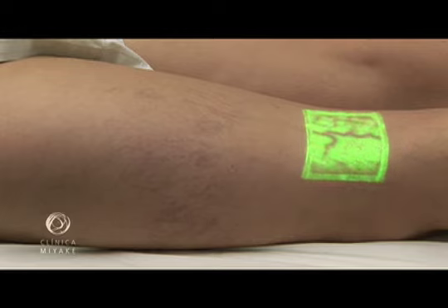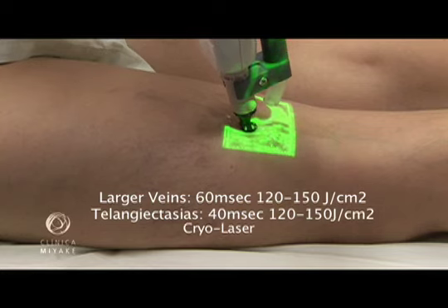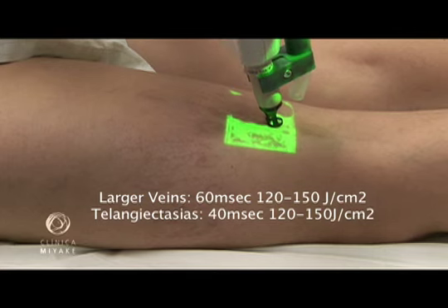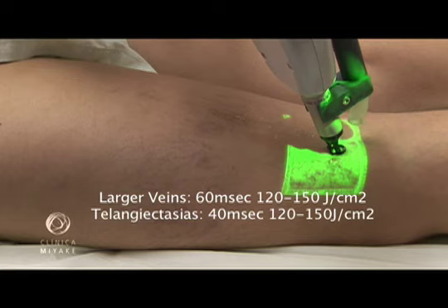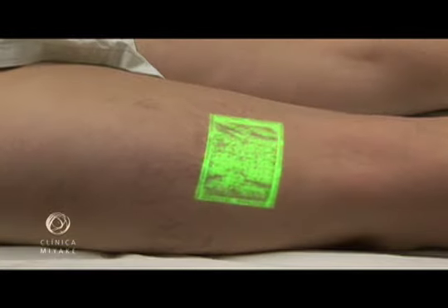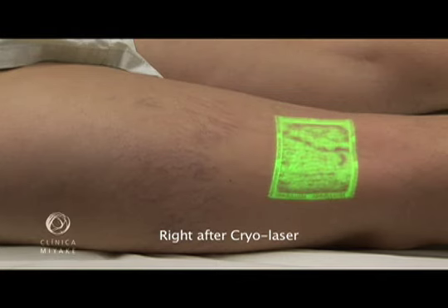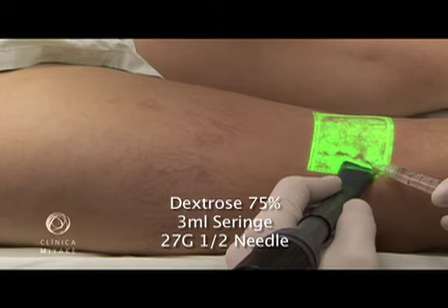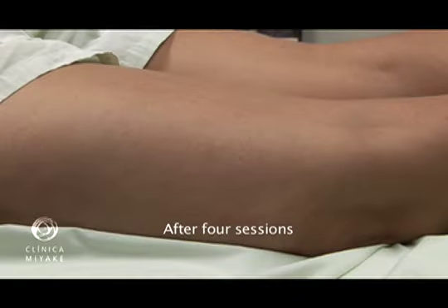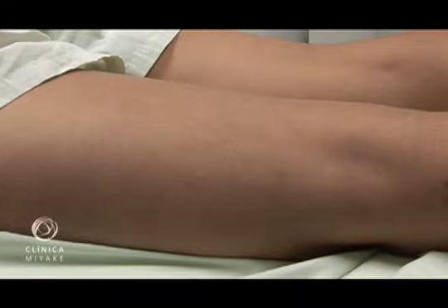The laser settings we use today are 60 milliseconds pulse duration and fluence of 120 to 150 for feeder veins and small varicose veins. After treating the feeder veins, to treat the telangiectasias, we change the pulse duration to 40 milliseconds, keeping the fluence. In both situations, we are allowed a second and even a third pass. After the laser shots, the sclerosant is injected also under cooling where the vessel is still open. And this is the result after 4 CLaCS sessions.